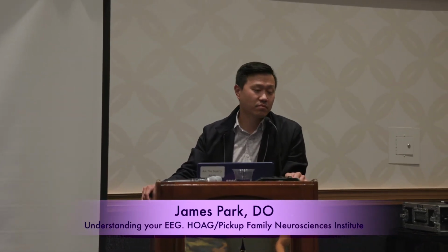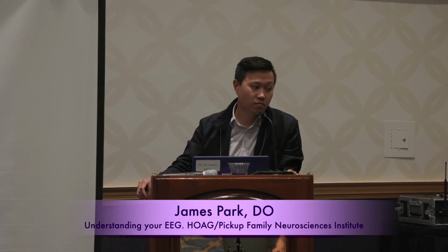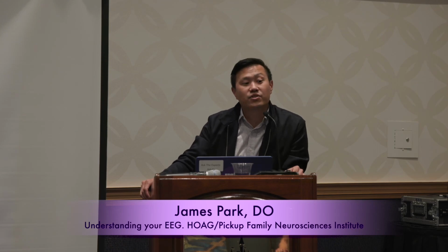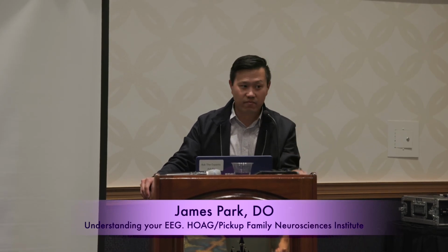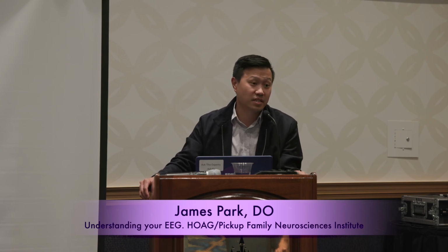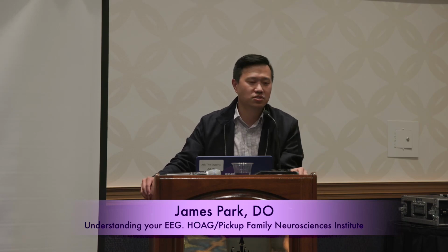On the at-home monitoring, can we catch the absence seizure on EEG monitoring? Yeah. So if you do a longer EEG, let's say an ambulatory one or even in the hospital, and she has an episode of staring, blinking eyes and things like that, you should be able to see that on an EEG. Unlike focal aware seizures, the generalized epilepsy seizures you should see.